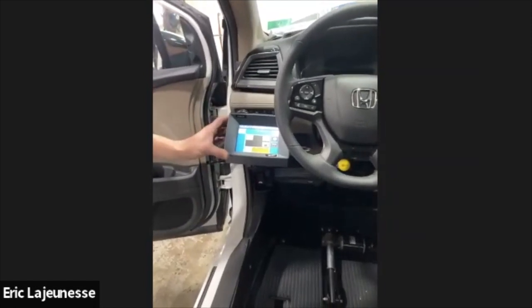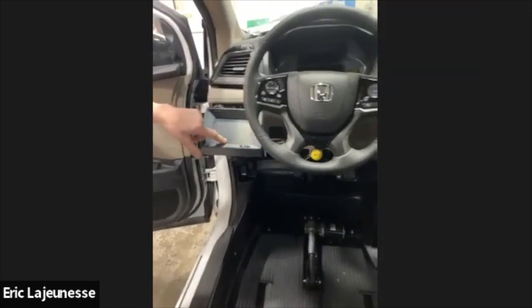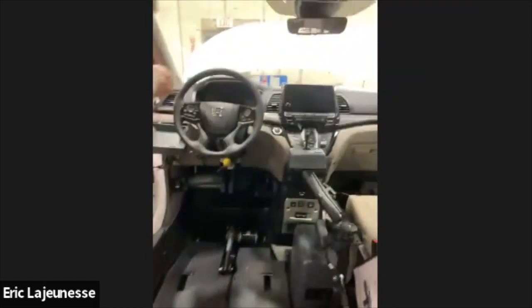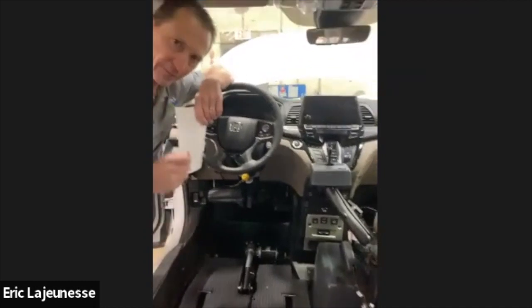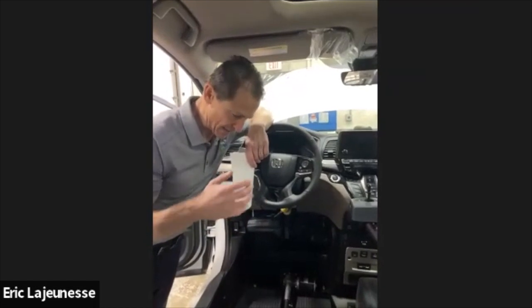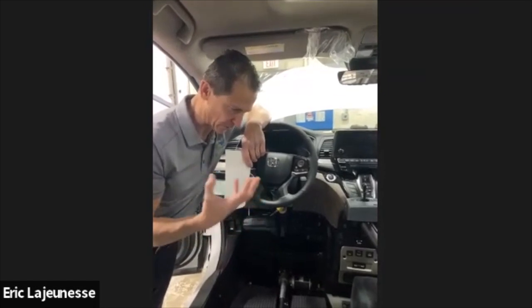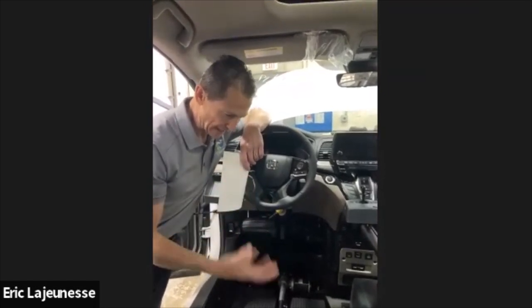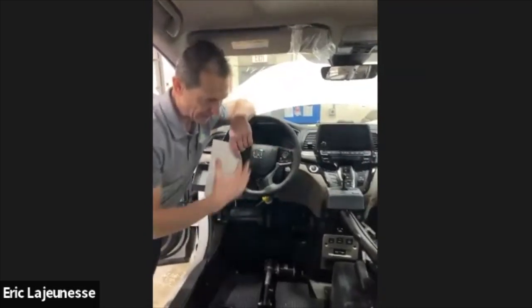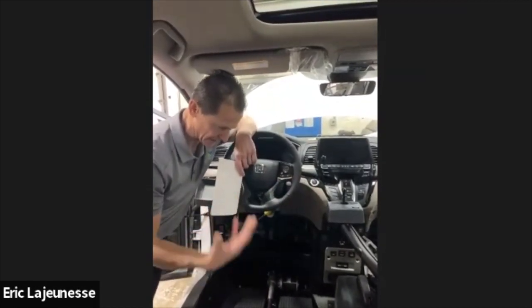So there's two types like we just looked at: the regular mechanical, which is what a lot of people do, or more of the high tech type of driving. Now, for any of the driving equipment, you have to be certified by a certified driving rehab specialist. I have a list of all the ones in New England that I can send out. They will meet and drive and assess to tell you exactly what is needed. And then a company like Mobility Works would install it, but there's always training involved.